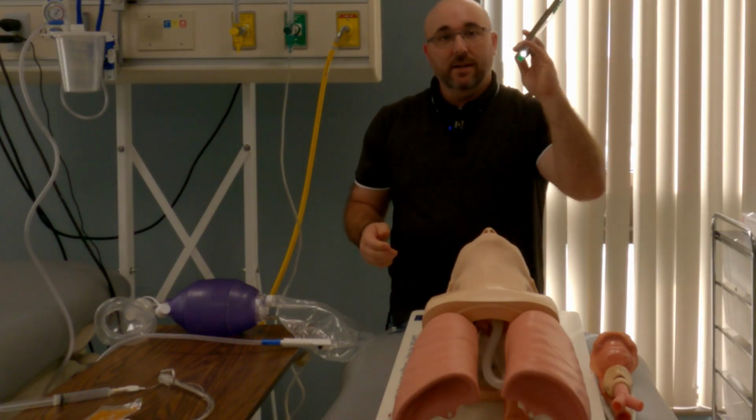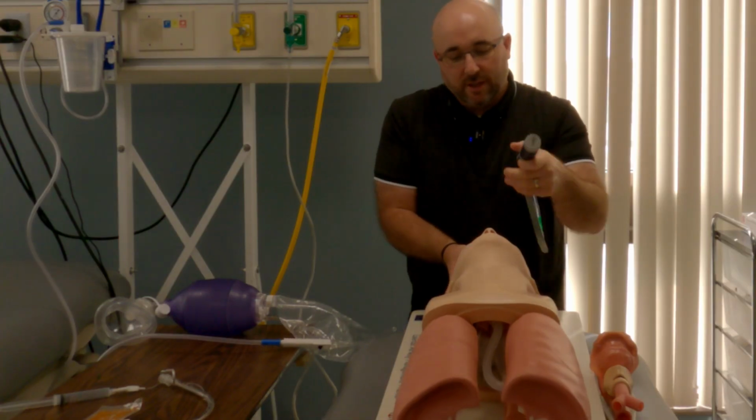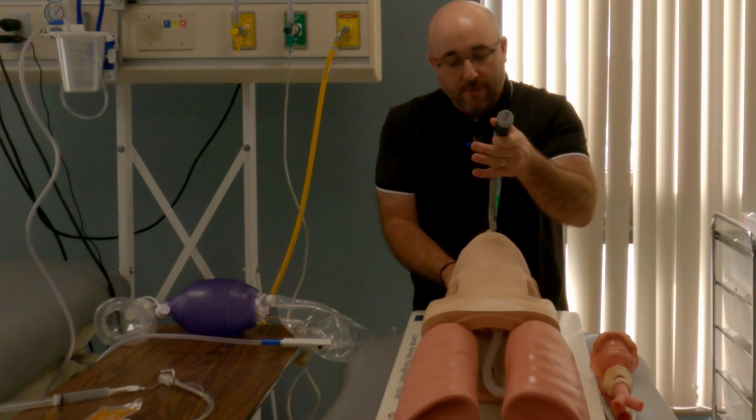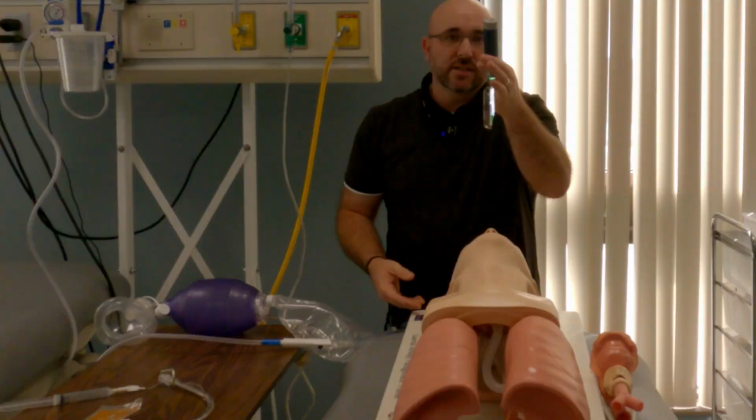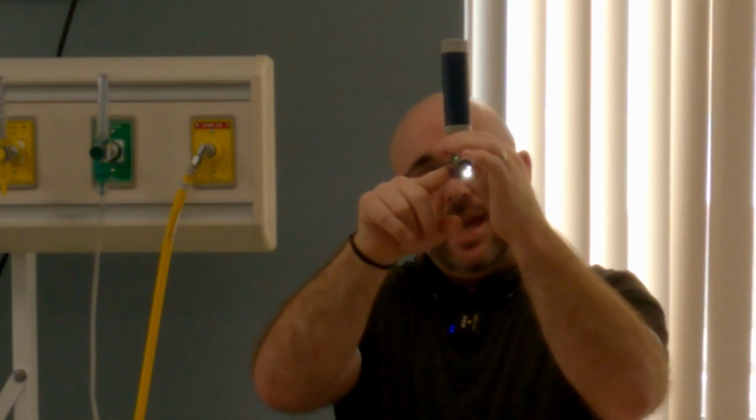The person intubating, you would hand them this, or they can grab this. Sometimes they'll keep this themselves, the laryngoscope blade and handle. They will go to insert. Now this always goes in with the left hand. This is a real generic intubation lesson. It always goes in with the left hand, and you can see the viewing areas here.